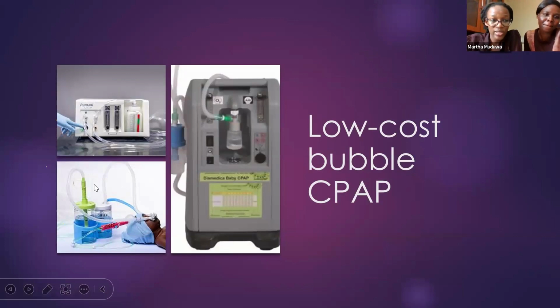Then we also have the Vayu CPAP, that also requires an external source of oxygen. You're able to blend oxygen with both these two. And then you have the Diamedica CPAP. This is the CPAP that we use in Mbale. This is a concentrator essentially that has two dials, the one of oxygen and air, and you're able to blend. And this is our pressure chamber over here and our humidifier.